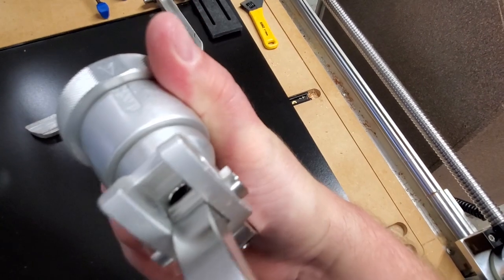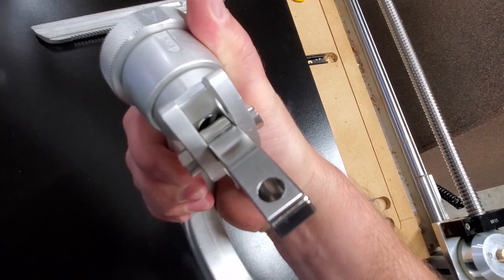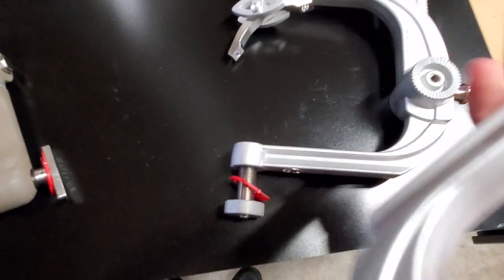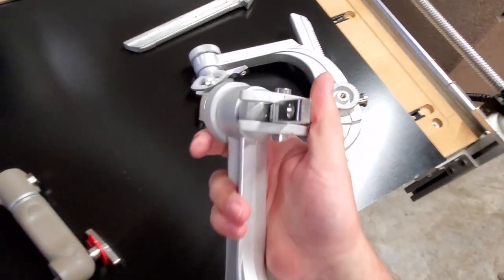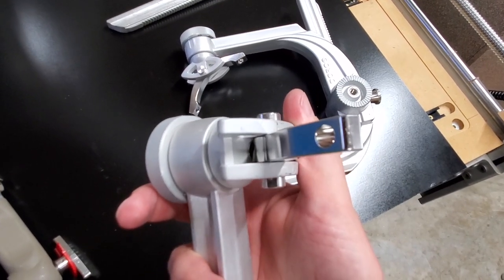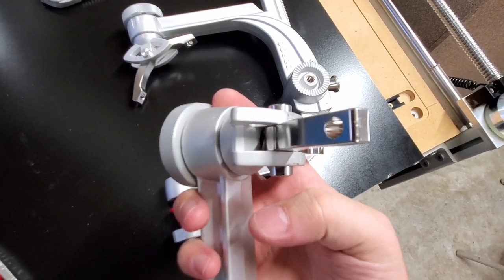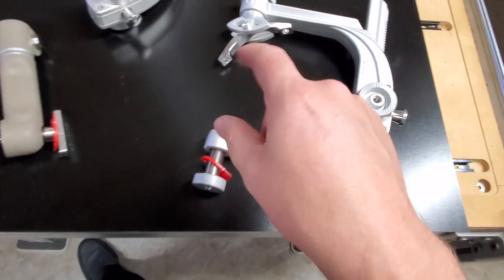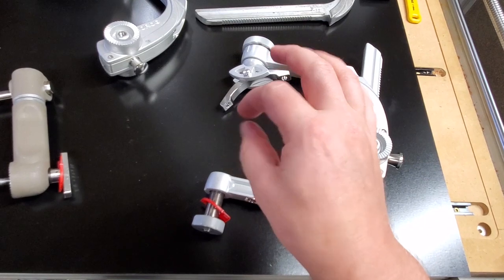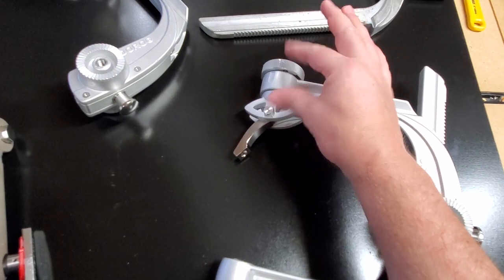And underneath that, you'll see a cap. I think that's what that one is right there on this version. Let's see if we got it on this one. These are all different age groups of skull clamps, so they will have a variety of different fasteners. Yep, I think that is a flat-headed cap right there. You can see it right underneath, right in there in that channel. It's a flat-headed cap. So once you take that flat-headed cap off, there will be a nut inside there that you can tighten or loosen. And on some variants, that will tighten or loosen this as well.